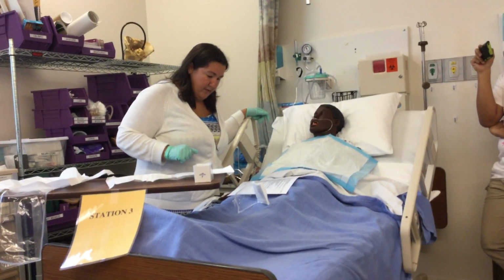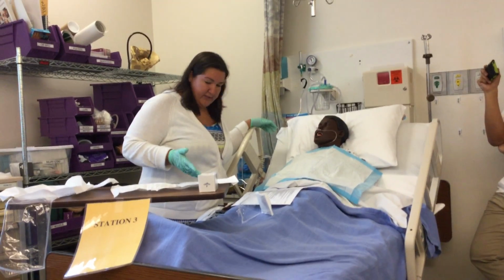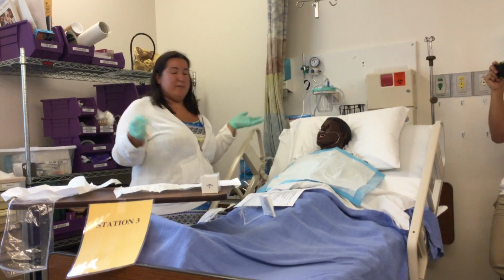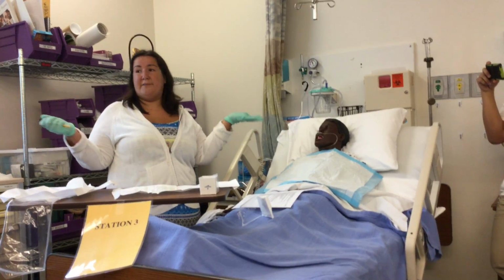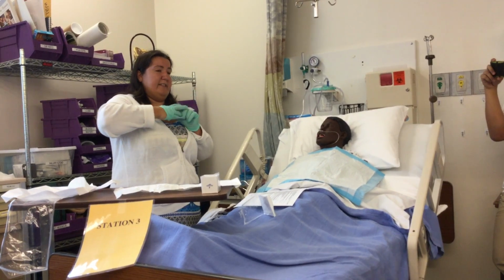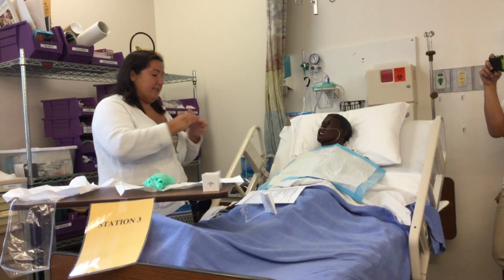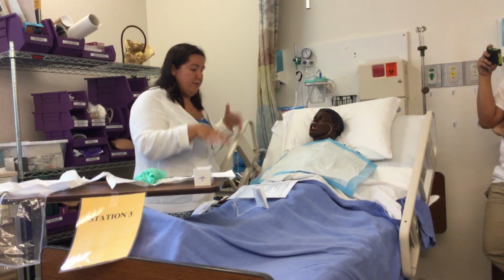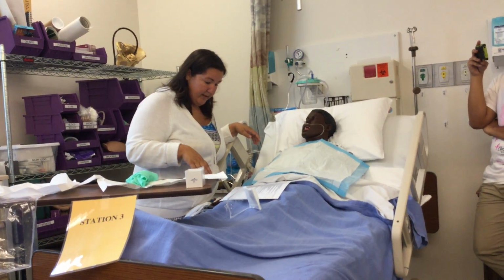I am going to get the patient comfortable. In the return, it actually says to roll this up, but if I'm still dealing with the stuff, I usually leave my sterile gloves on unless they're really contaminated. If you have all sorts of stuff on your gloves, you want to take them off. But for the return, they say you can just take these off, roll it up in there, and then clean your hands. If it's not really dirty, they're still a pair of gloves, and you can use them to clean up the room. Just make sure you take those off and then clean your hands after you take them off.